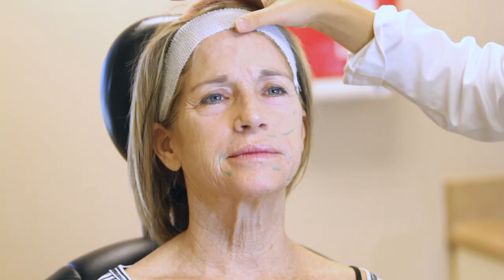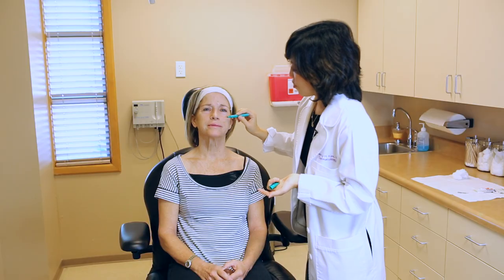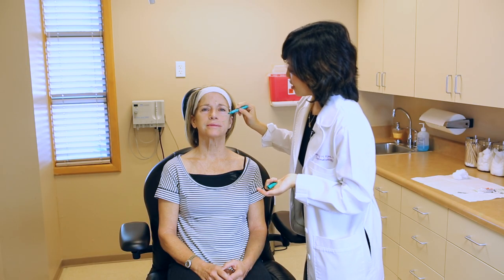Laser resurfacing gives you such a more natural look without having all this extra unnatural product put in. And since we're lasering her, we're probably going to do her eyes too, because there's always that crepey skin right below the eye that nothing can fix. Laser can definitely tighten that skin up.